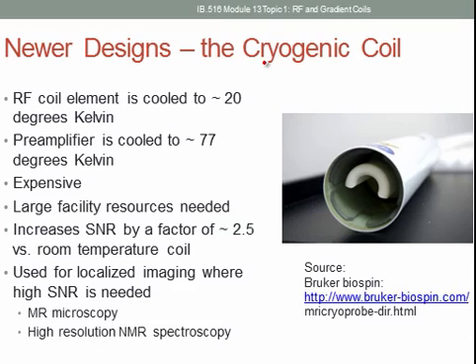And the last coil I'll talk about is a cryogenic coil, which is really neat. Mostly, I think it's right now only used for animal imaging.